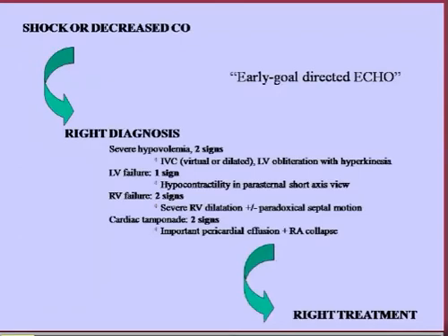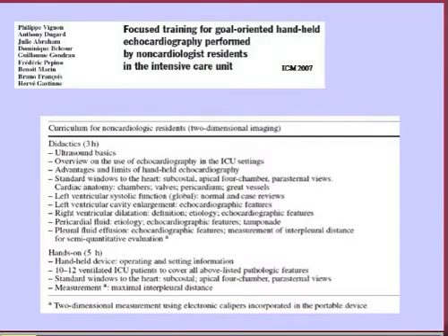And Benjamin's team in New York called this approach early goal-directed echo. And you can be very confident by using this approach, because this was clearly demonstrated by Philippe Vignon, who is working in Limoges in France. And he demonstrated by applying 3 hours of didactics for intensivists associated with 5 hours of hands-on.